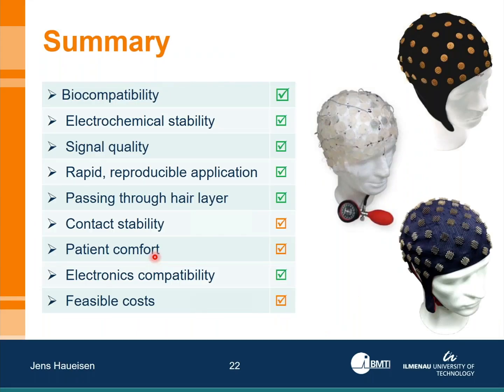We have by now achieved with our dry electrodes quite a number of important steps. They are biocompatible. We have decent signal quality. We find a very nice situation in terms of electronics compatibility, but of course there are open issues. Contact stability in terms of caps is still something we're working on. Patient comfort is not always perfect. Fitting of the electrodes is not always perfect, and costs are also not yet where we want them. But this is ongoing work, maybe for the next talk.